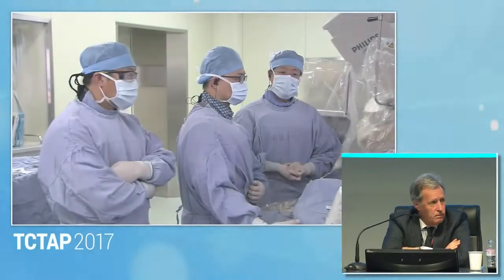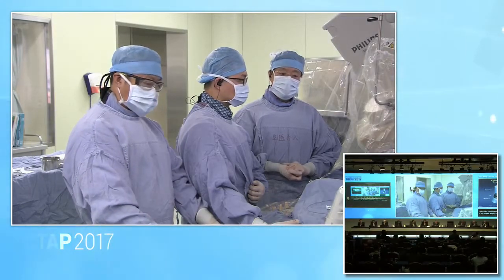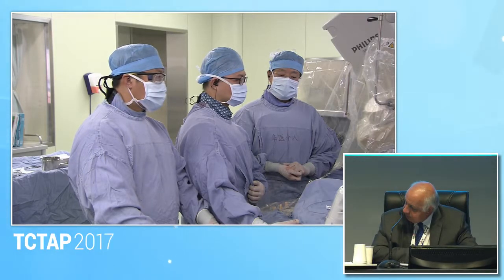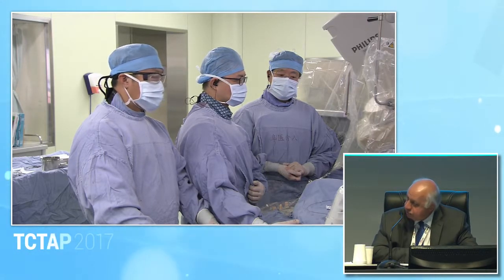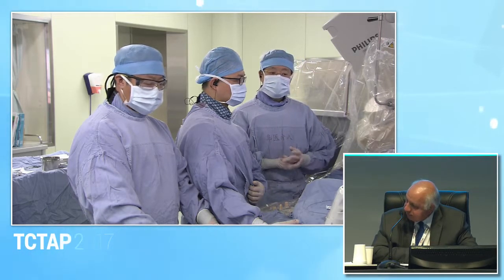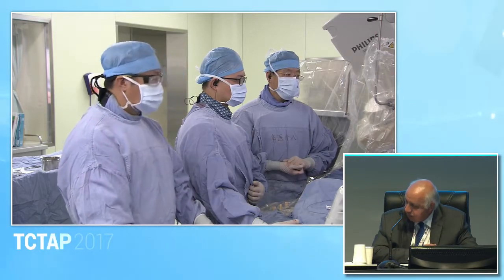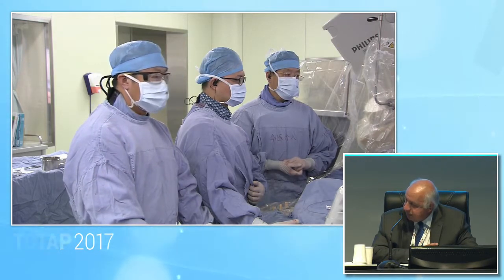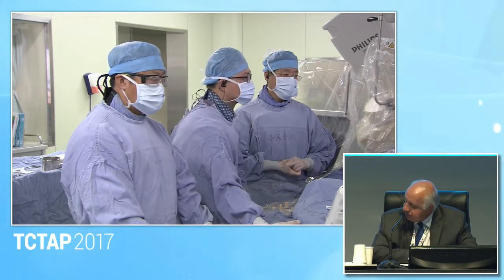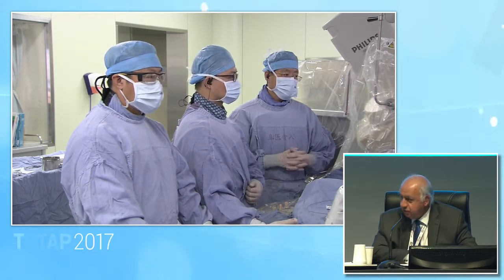Can I ask a question? If the patient goes to surgery, is the surgeon going to graft the two OMs or one OM only? If the surgeon is going to do one OM, then I will leave the distal CX. If he's going to do the two OMs, which is so difficult for the surgeon, I'm going to tackle it before left main stenting. If you believe that the right coronary is diffusely diseased and small, you're not going to do anything for the right, so you have to complete the CX in two arms. This is my opinion.